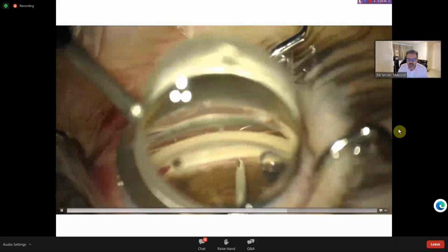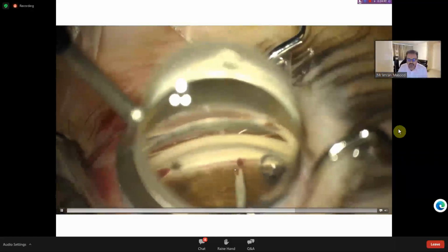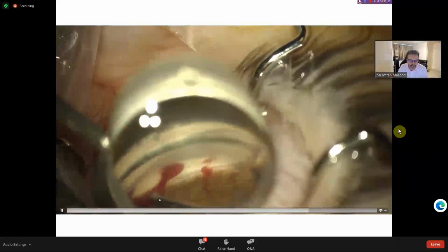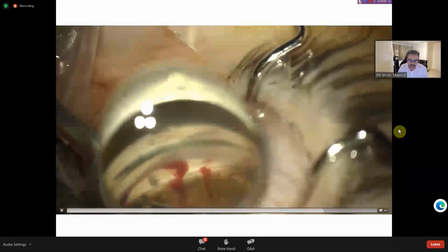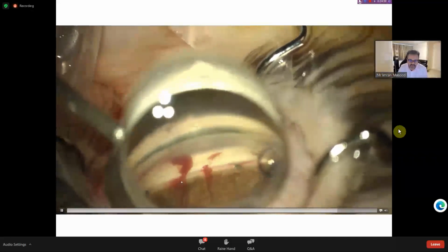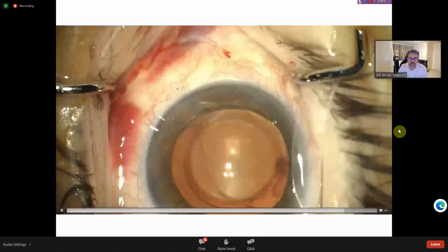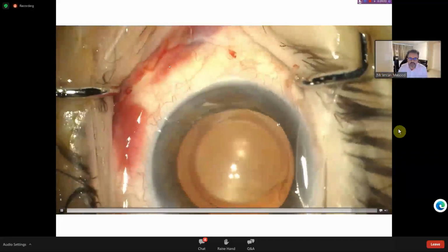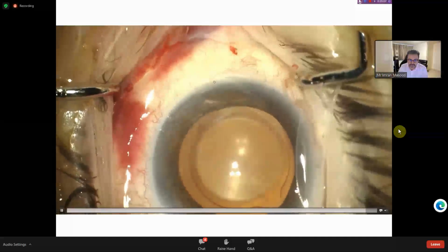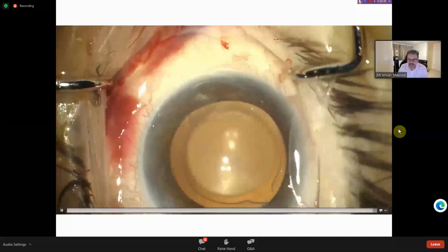So it's very important to keep everything nice and still, nice and steady, and then you see that you get that reflux again. Let's just have a look over here. That's the first one already implanted. So that's a good distance apart, so you get maximum benefit in terms of getting access to all the collector channel network. And have a look here again as we look at that absolutely beautiful reflux or blanching of the episcleral vasculature to show that this stent is in the right place.